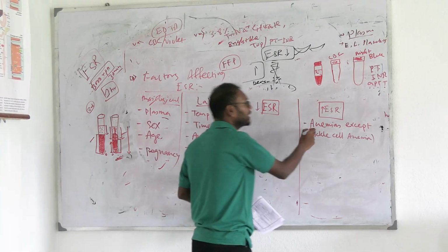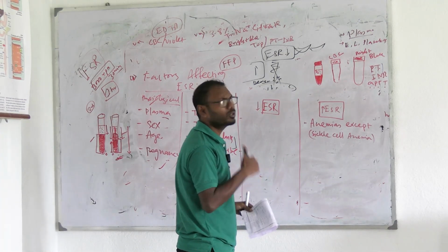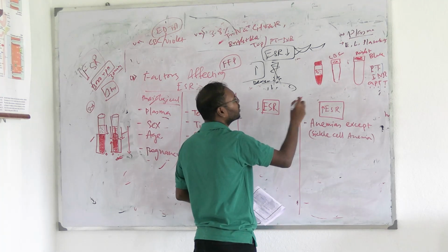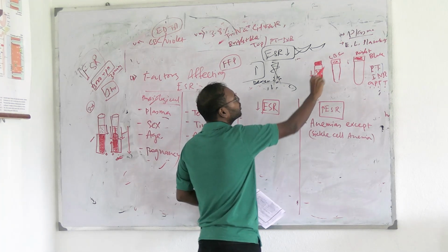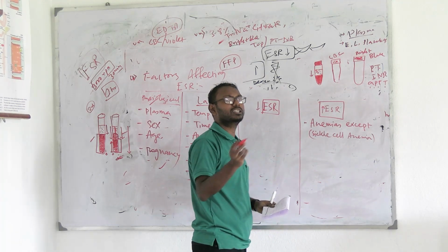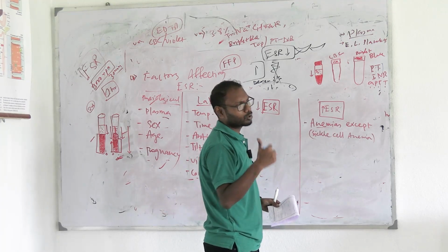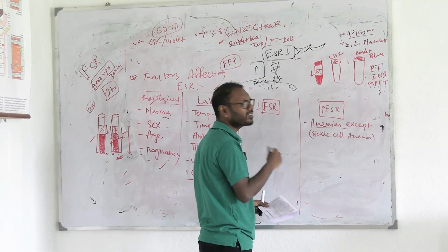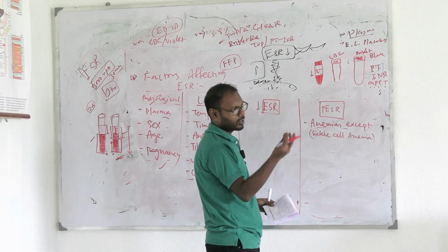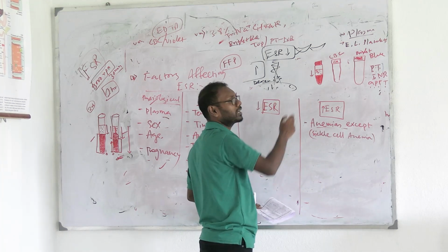Okay, now if you have very low erythrocytes, if you have a very low amount of erythrocytes, what will happen? This packed cell volume will be very less, and also the sedimentation rate will be high because you have fewer erythrocytes to sediment, so it will sediment much faster. It will happen very quickly. The fewer erythrocytes I have available, so the available erythrocytes in anemic patients are very much less, so it will take less time to sediment. The less solute I have, the less time it takes for them to sediment, and the less time I take, what will we say?